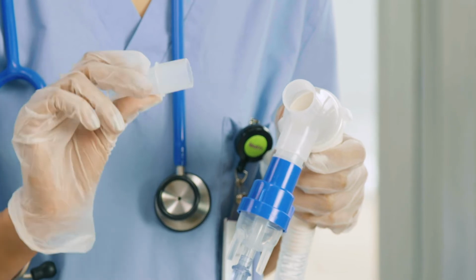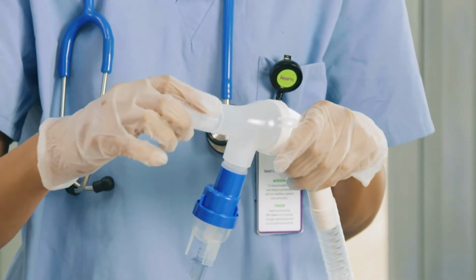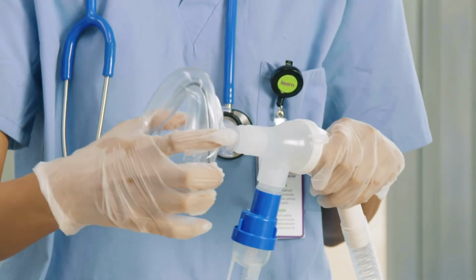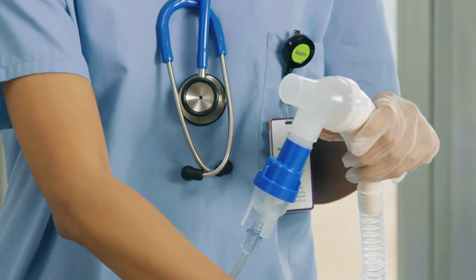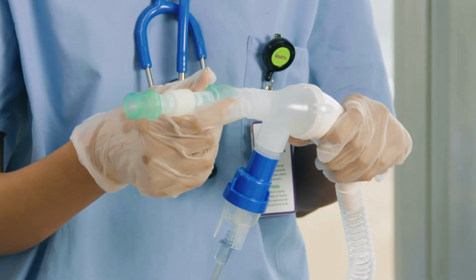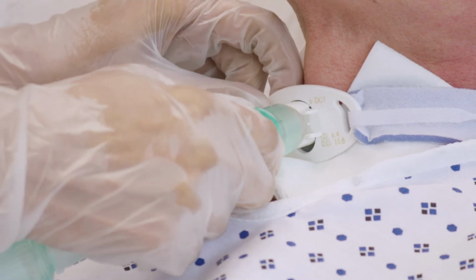When using the mouthpiece, insert and twist into the output port of the clear spontaneous breathing adapter. For face mask use, insert and gently twist the 22 by 22 mm adapter into the output port, then connect the other end of the adapter to the face mask. When using the flexible tracheostomy adapter, insert and gently twist the 22 by 22 mm adapter into the output port of the clear spontaneous breathing adapter, and then connect the other end of the adapter to the flexible tracheostomy adapter.